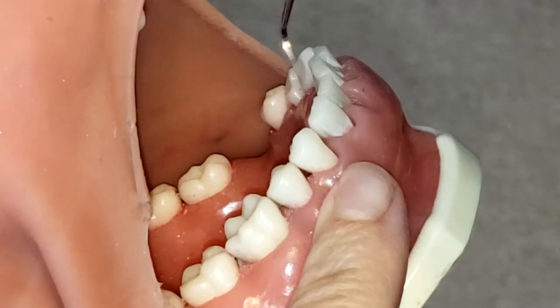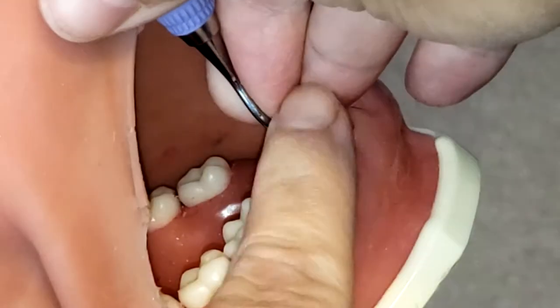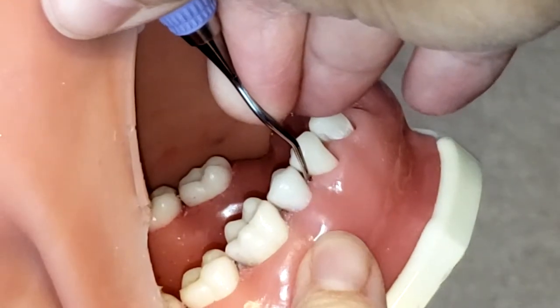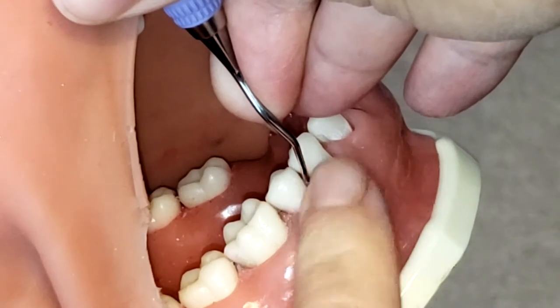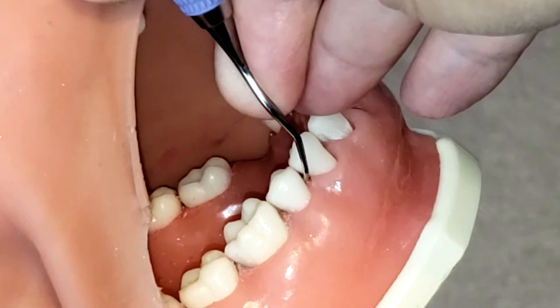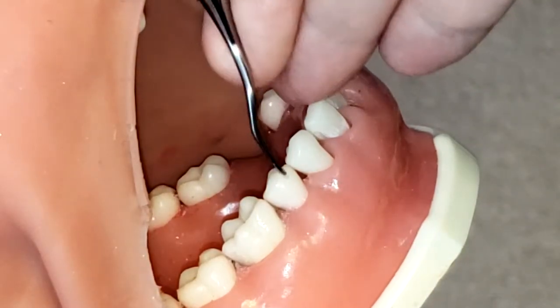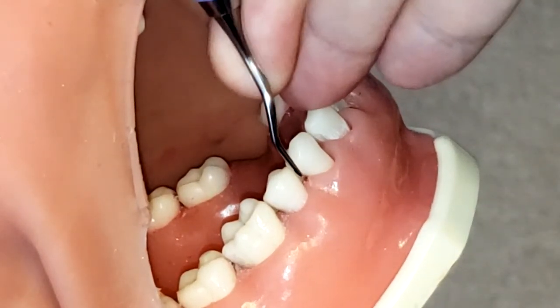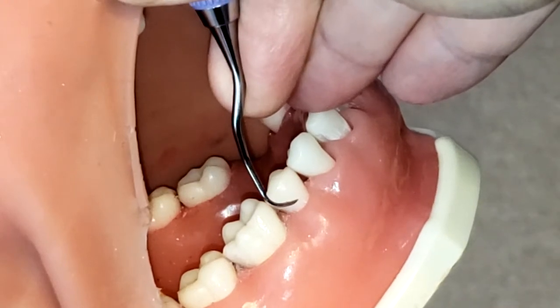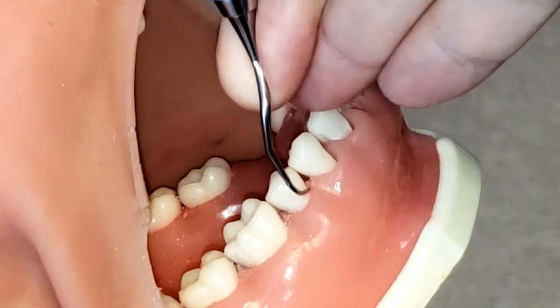Now if I were to put the wrong end in here, you see that it doesn't create that V on the distal surface — the V is more pointing towards the mesial surface, so that is incorrect. The correct end hugs the mesial.